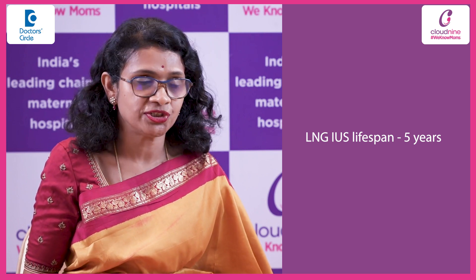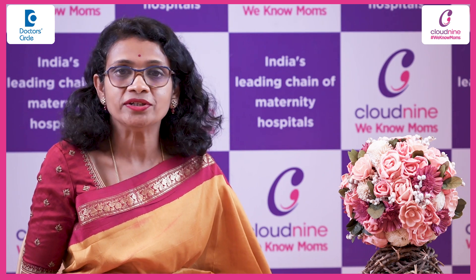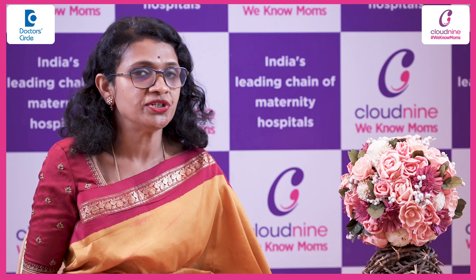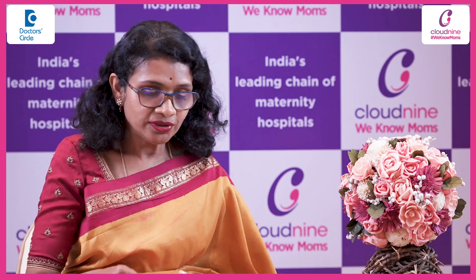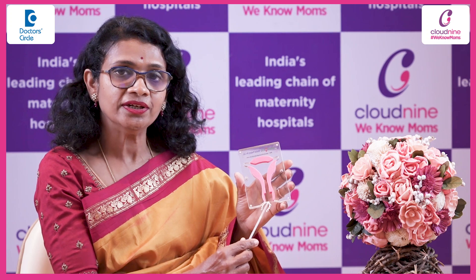Coming to the procedure — prior to inserting the intrauterine device, your doctor will be checking your vitals and taking a consent. The procedure is usually an outpatient procedure. It doesn't cause pain; it just causes a little discomfort. I will now be showing you how to insert an intrauterine device.